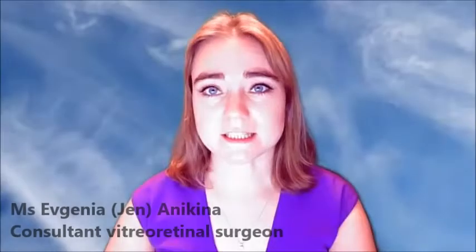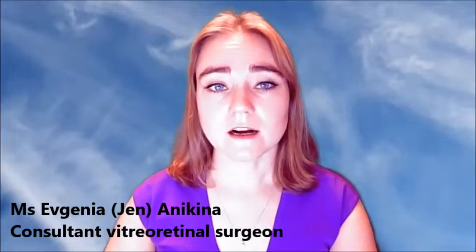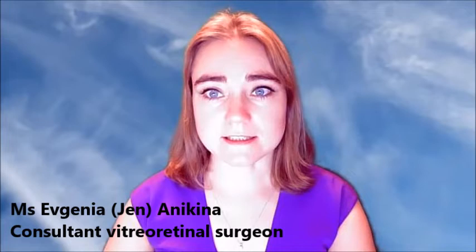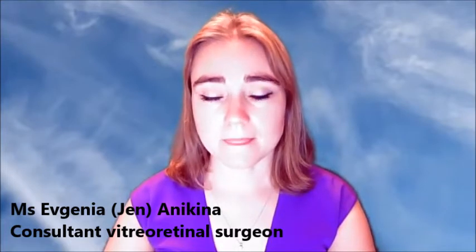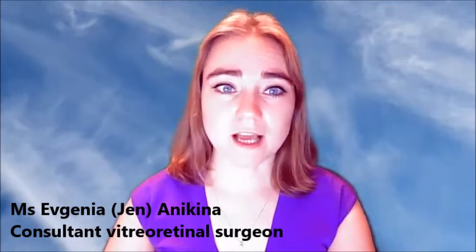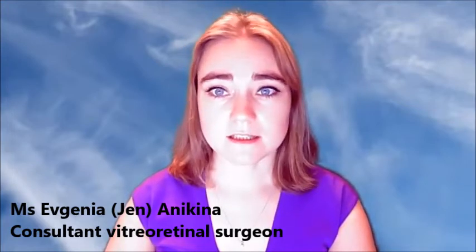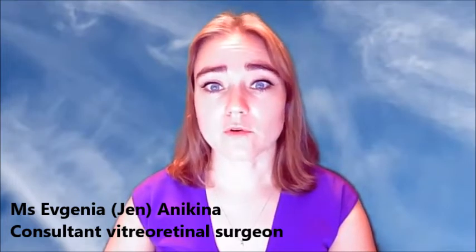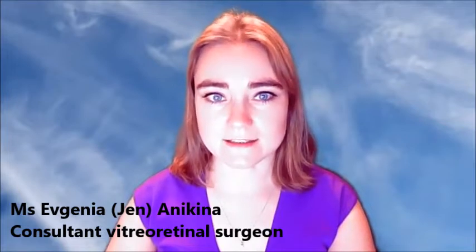The more common reasons to require a secondary lens are complications of cataract surgery, eye trauma resulting in lens dislocation, or spontaneous lens dislocation due to time-weakened support structures inside the eye. Occasionally, patients are not happy with the power of their implant or the visual effects they get from it, in which case they opt to replace an implant with a different model. There are also some genetic problems associated with a higher risk of a dislocated lens.